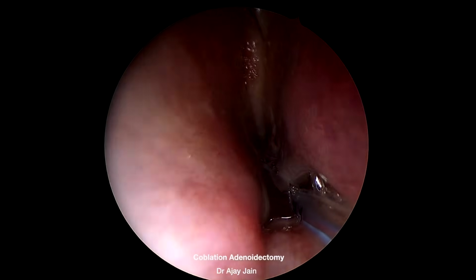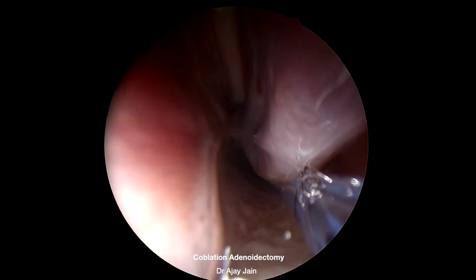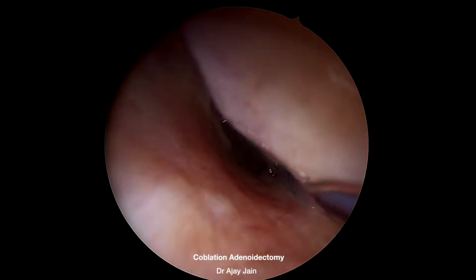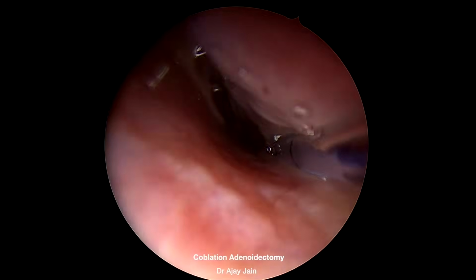Now the right side is completed. I am going to the left side. On the left side there is a deviated nasal septum. Still no issue. Negotiating carefully to the nasopharynx.